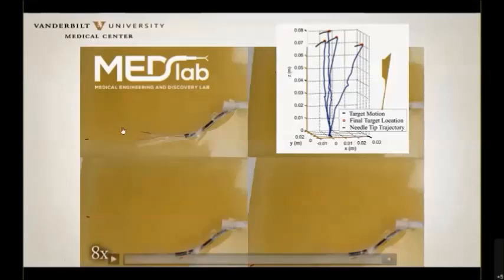This is also possible in a moving target as long as you know exactly where the target is going to go. This is what you have in this little drawing here. The point I'm making here is that electromagnetic navigation is extremely accurate. You really can hit a fly on the wall across the room. The problem is that you don't really know where the fly is located anymore when you are relying on a preoperative CT, and that's really what the problem has been.